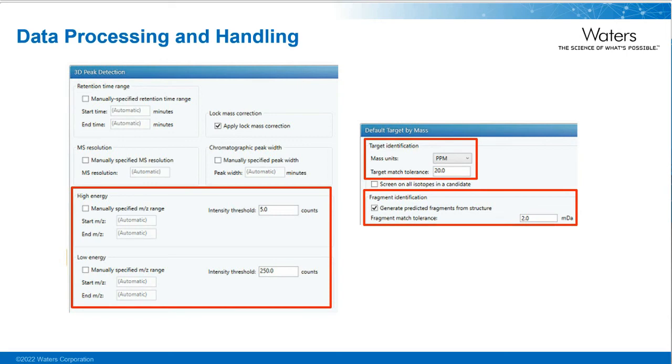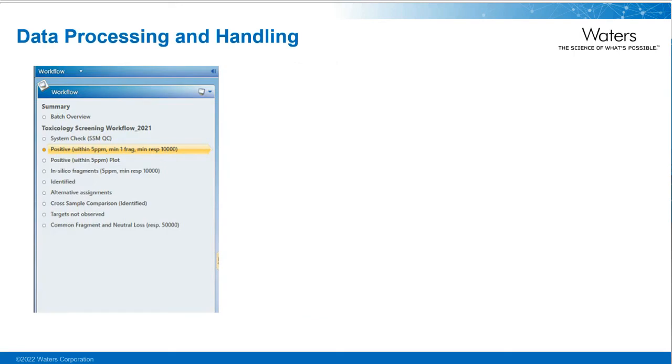Use of broad criteria ensures a metaphorical wide net is cast to capture any significant compound identifications. These identifications are further processed with the aid of workflows. A workflow contains a set of customized filters and defined parameters which display data harvested from the initial processing step and is presented in a tiered arrangement from the most confident result to the results that require a little more investigation.